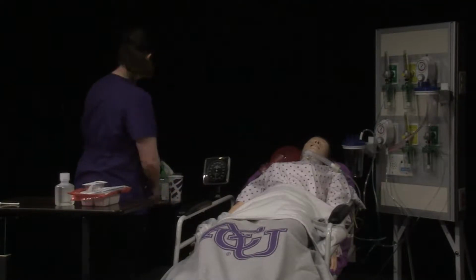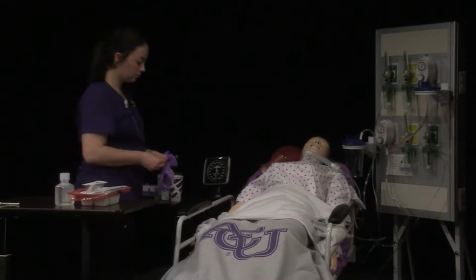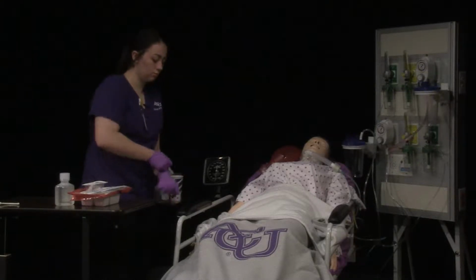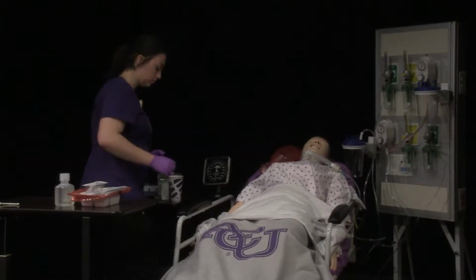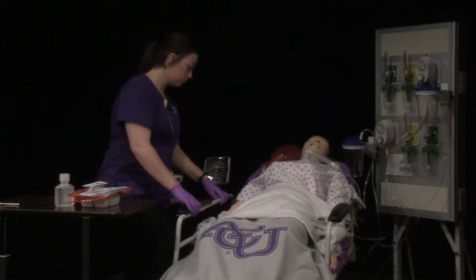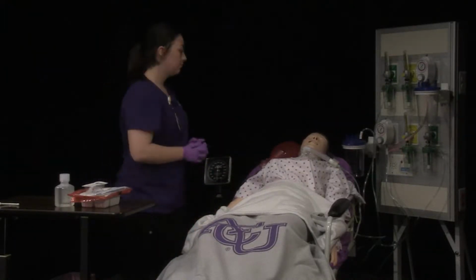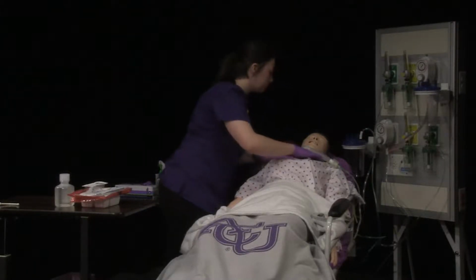Don clean gloves and apply proper PPE. Raise the bed to working height and lower the side rails as appropriate and safe. Assess tracheostomy for placement and patient for respiratory status.